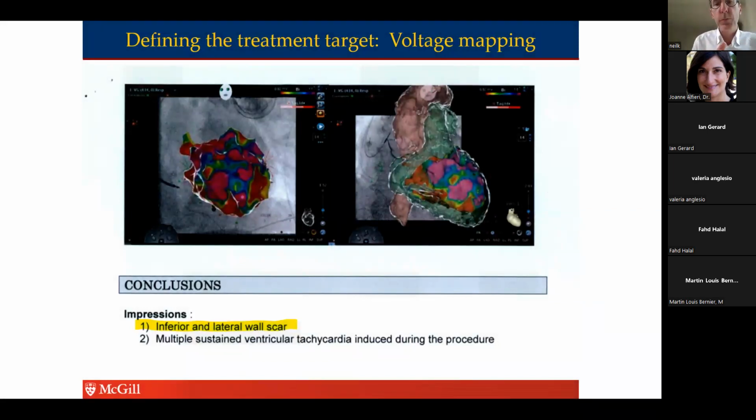I don't want to reiterate, but the name of the game is to contour out, identify the target within the heart. That's been done before the patients come to the Department of Radiotherapy via the various means, functional and structural imaging approaches to identify the substrate within the heart. And our job now is to translate that information concretely. We need to draw out our target for radiotherapy within the heart.